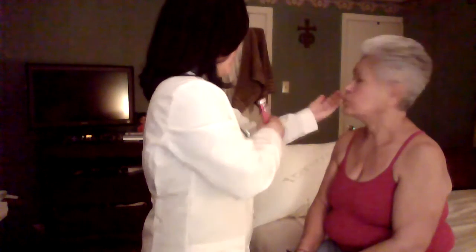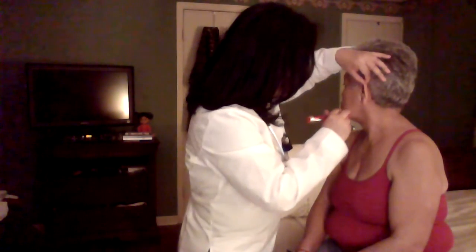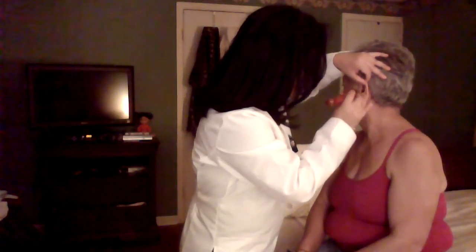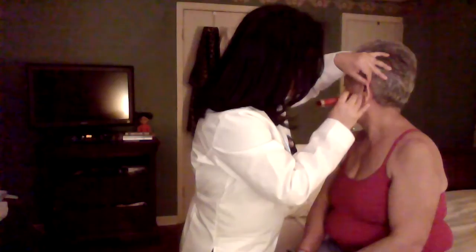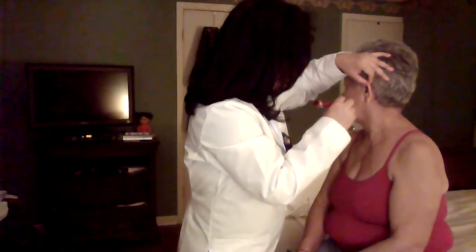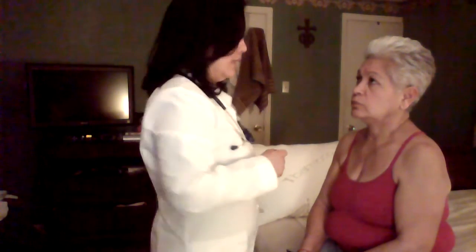I'm going to ask you to turn all the way to the left, and I'm going to repeat again. I gently pull up and back the ear so I may place the speculum of the otoscope inside. And again, I'm going to be looking at the ear canal, the color, and the mobility of the tympanic membrane. I'm also going to look for light reflex, and for the landmarks: the handle of the malleus, the short process of the malleus, and the cone of light.